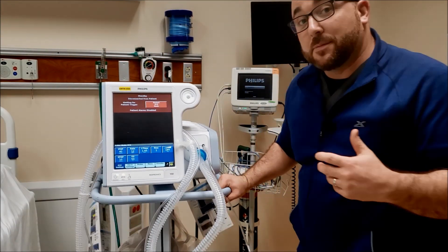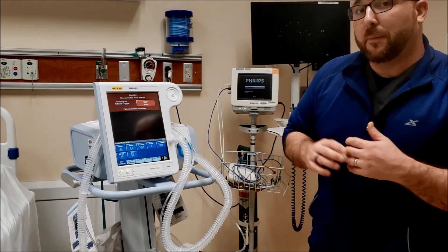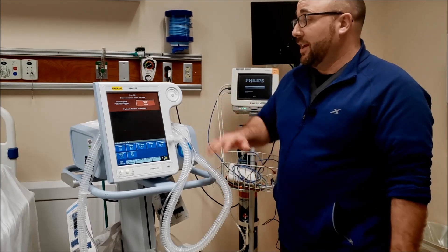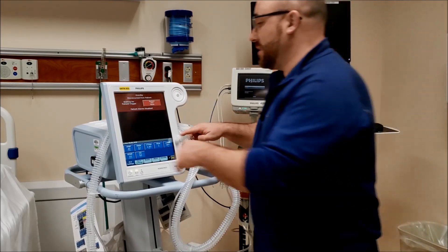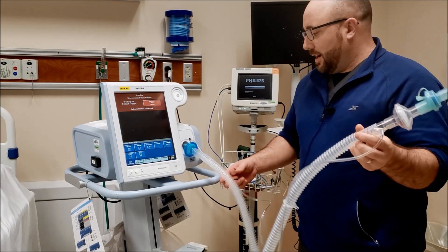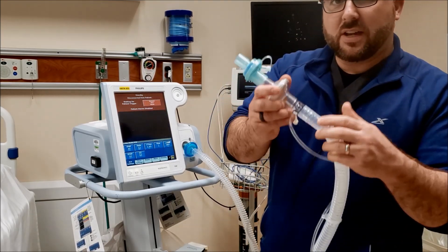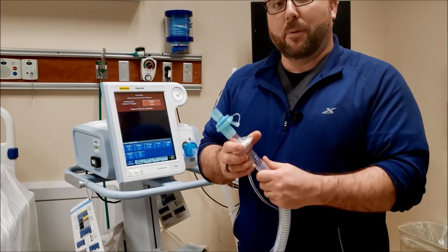The 100% oxygen comes in and gets blended to whatever we set on the machine. If you're used to Puritan Bennett ventilators like the 840 or 960, this works somewhat similarly — it's got a touchscreen and a lot of nice options. You're also going to see it has a single limb circuit. You inhale, the mask is on the face — how do they exhale? It has an expiratory valve, so the CO2 can come out. It's really important to keep that open at all times.